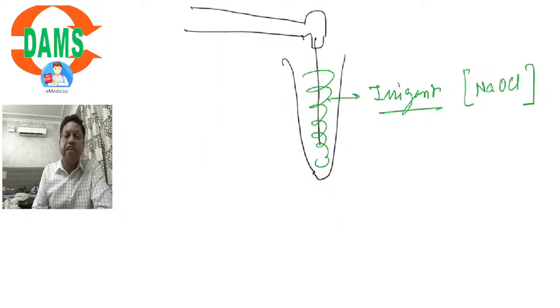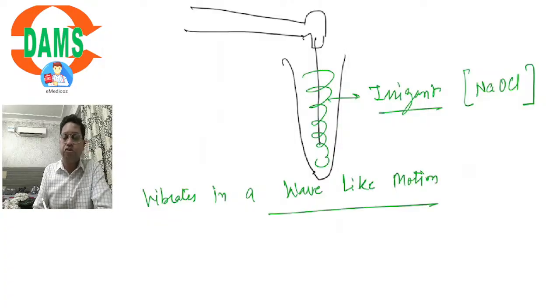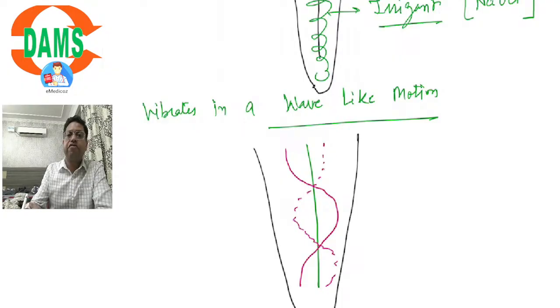Now, whenever this file is suspended with an ultrasonic handpiece and placed inside the fluid, it vibrates in a wave-like motion inside the root canal.